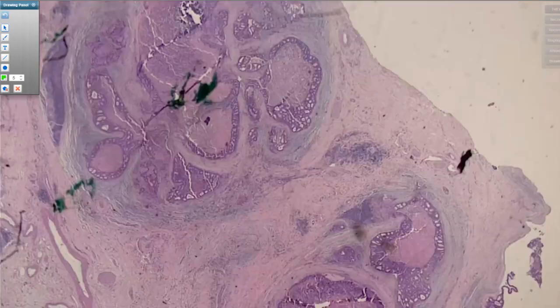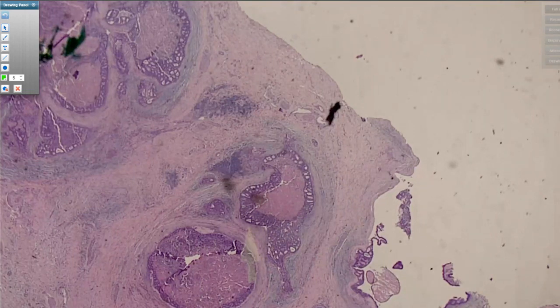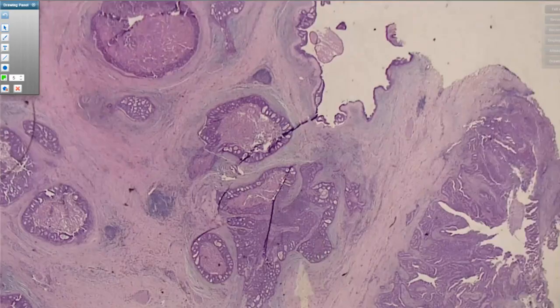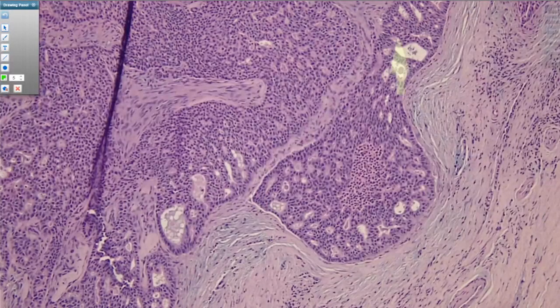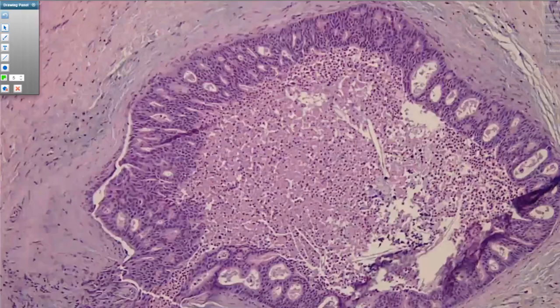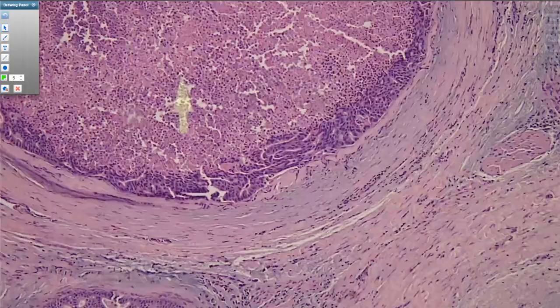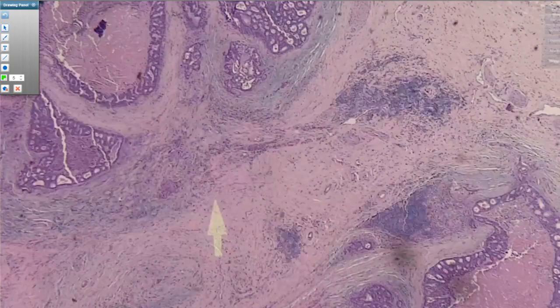Here's another example that I think even more strikingly resembles DCIS of the breast. You can see again how the architecture is really comprised predominantly of these beautiful little tubules. You'll often see central necrosis within these nests. And again, they expand out with this pushing growth that it's hard to pick out any one of these and say for sure that it's invasive.